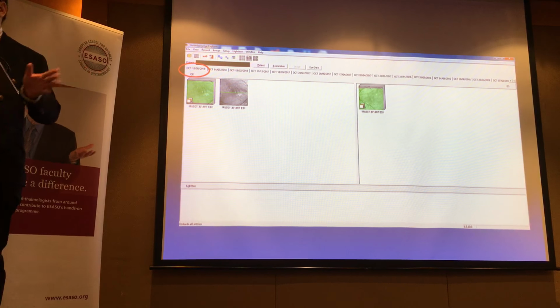Many times though, when I walk into the room, before the patient has even walked in, they open the OCT scan and tell me, yeah, I need to jab this patient, right? It's a faster way I run through that because the patient will be elderly, coming in slowly, etc. But you already have a preconceived notion. But in any case, let's talk about this patient. So she came in, I examined her, as is my practice, and I smiled at her and said, good, that is better.